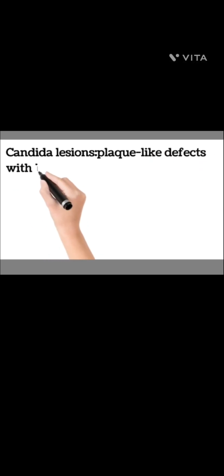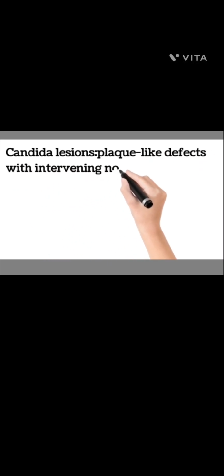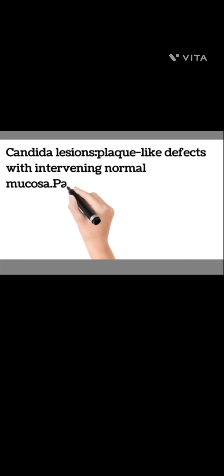Fungal infection like Candida occurs in immunosuppressed patients like AIDS. On barium study, there is plaque-like defect with intervening normal mucosa. In AIDS patients, confluent plaque and pseudomembranes cause shaggy esophagus.